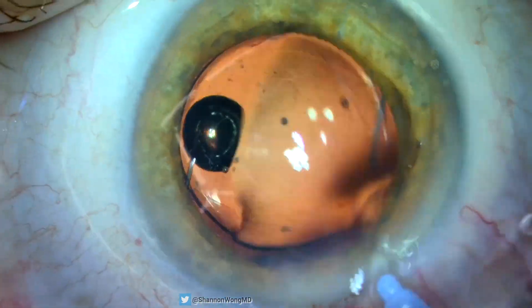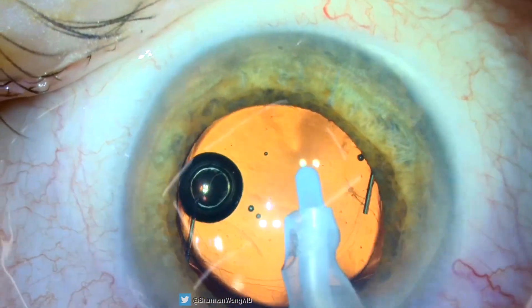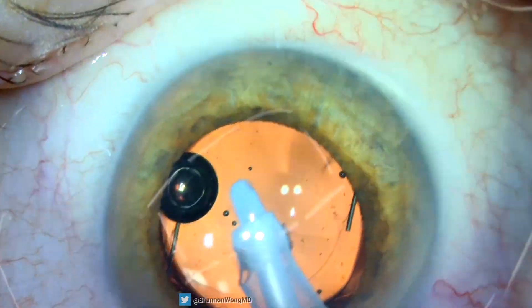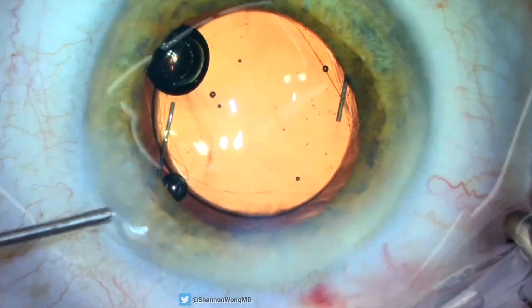We then seal our incisions with BSS, then sweep below our primary and secondary incisions to make sure that there is no vitreous prolapse. This patient ultimately achieved a great visual outcome.